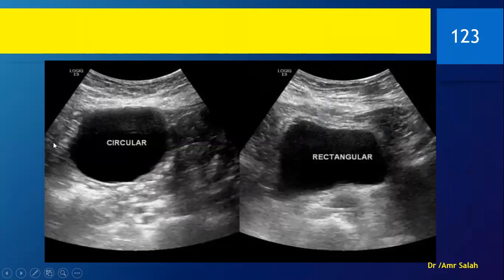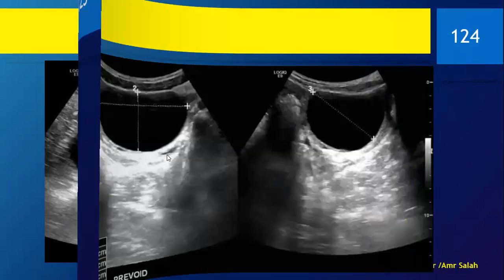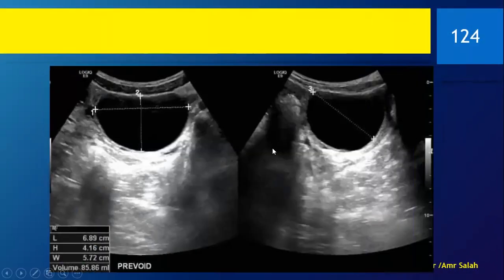If the bladder looks like this, you might ask her, do you want to pee, if all of this is her bladder? If it's not the case, ask her to drink some water in order to see the bladder. Of course, if it is the bladder, after peeing it would change in size. So these are just clues to make you distinguish entities from each other. And the thing that makes you suspect is that this doesn't look like the bladder.